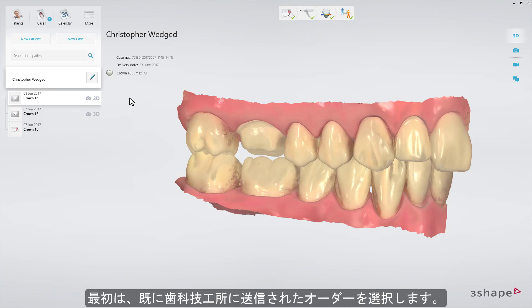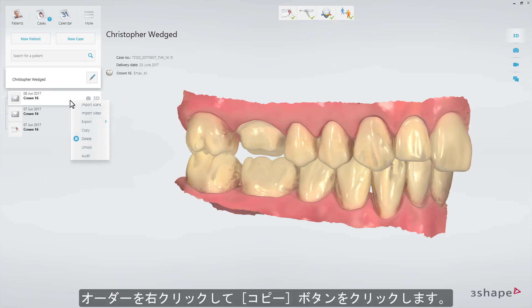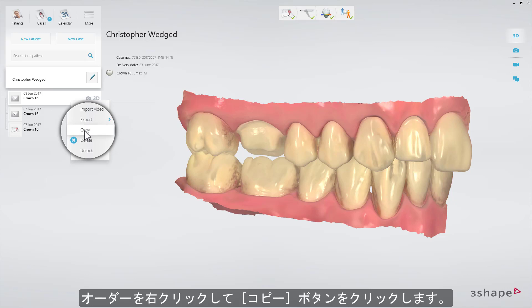Start with a case that has already been sent to a lab. First, right-click on the order and select copy.